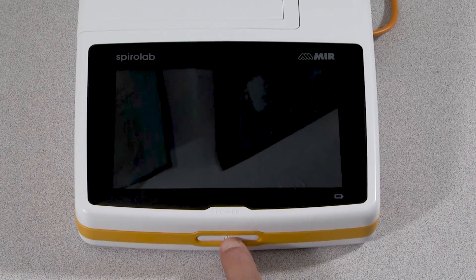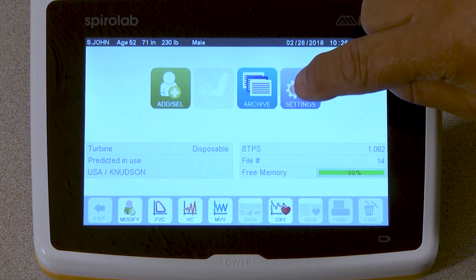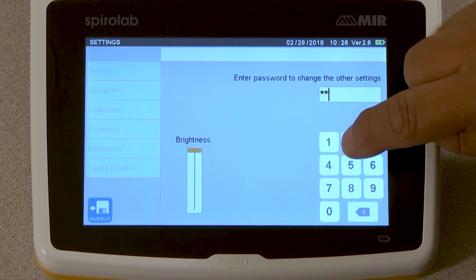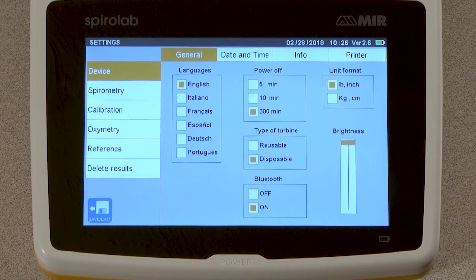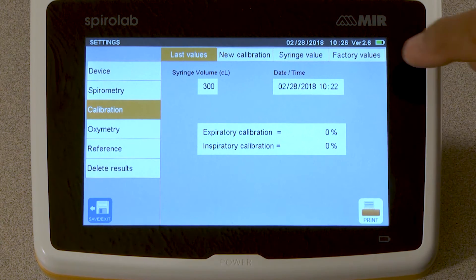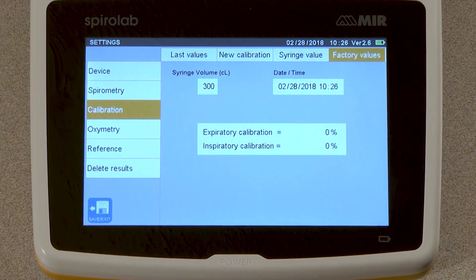Turn on the SpiroLab, and at the home screen select Settings. Tap the box to enter the setting password. The password to enter settings is 1-22-333. Select Calibration from the list at the left side of the screen. This will take you to the calibration menu. Select Factory Values and tap OK to confirm factory calibration.